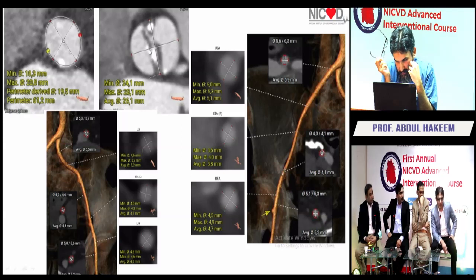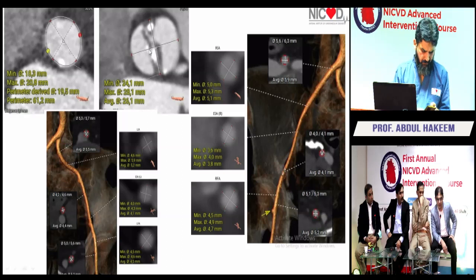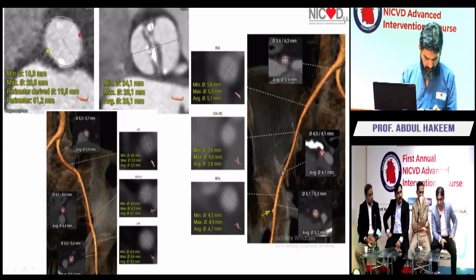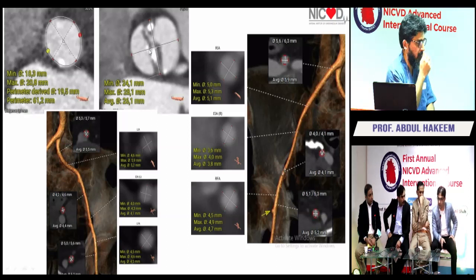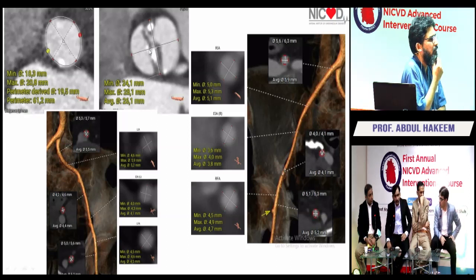95% of the cases can be performed through transfemoral, and if we tend to go to other sites, for example, subclavian sites or axillary sites, they are a little ergonomically challenging, more radiation. And then when we go to the carotids, in some centers, it is their number one alternative choice after transfemoral. Some reports of a little higher rates of stroke. Axillary access has about 5 to 6% risk of stroke.